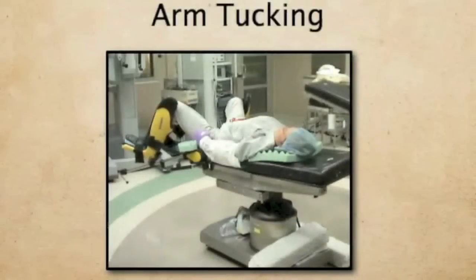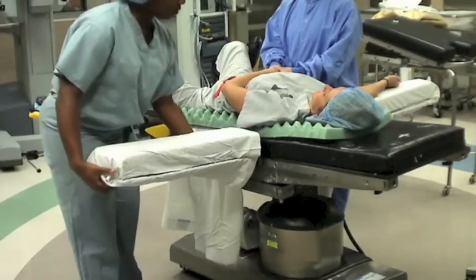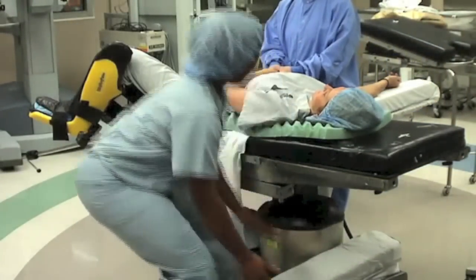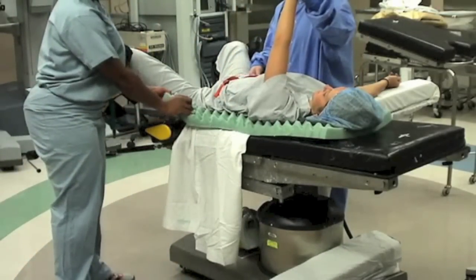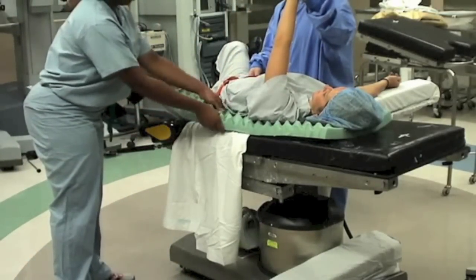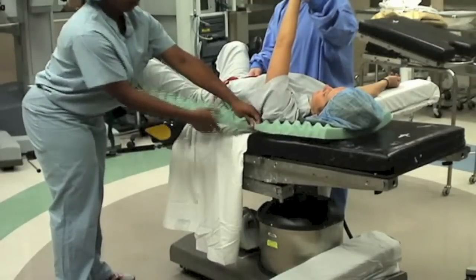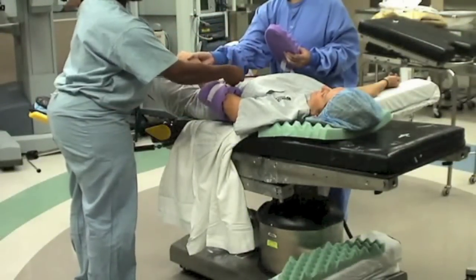Arm tucking. Arms are tucked at the patient's side to allow the surgeon to have more room to operate during laparoscopic and robotic surgery. The arm boards are removed. Excess egg crate foam is removed from the patient's side to allow for tucking. Cushioning is placed over the elbow and the wrist.